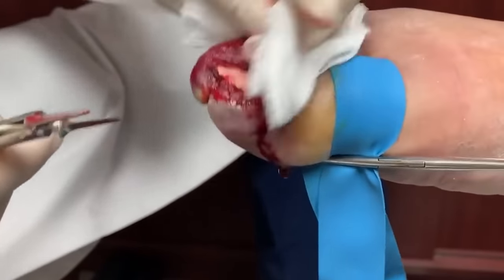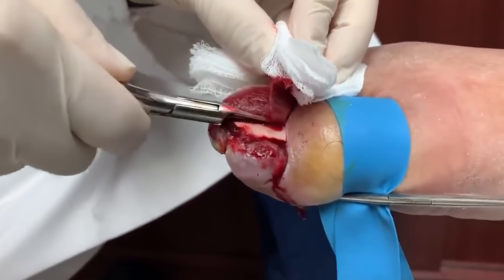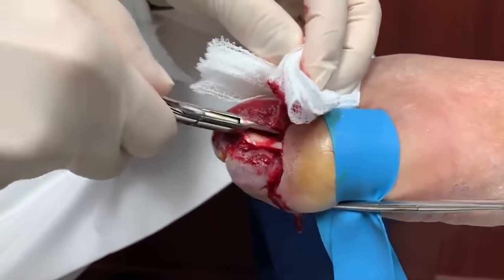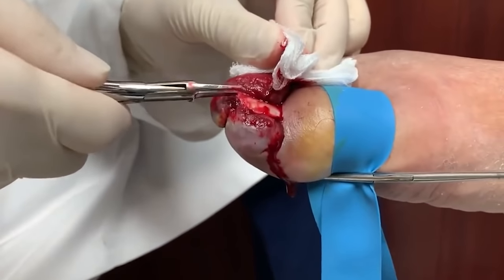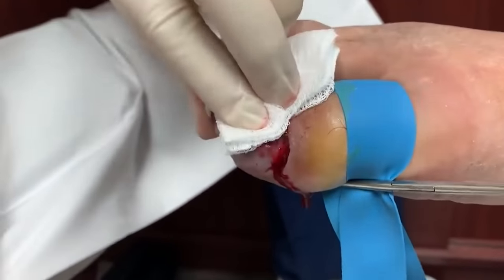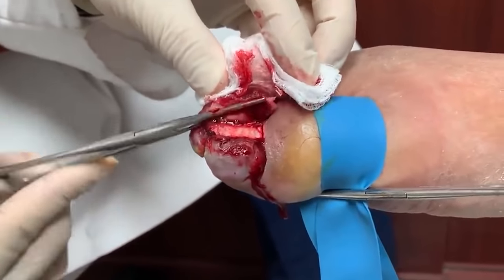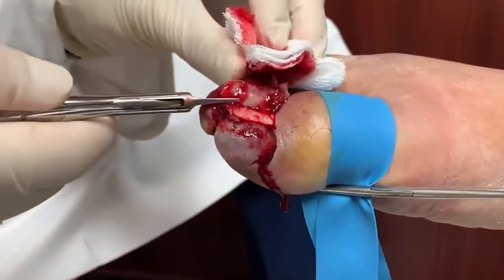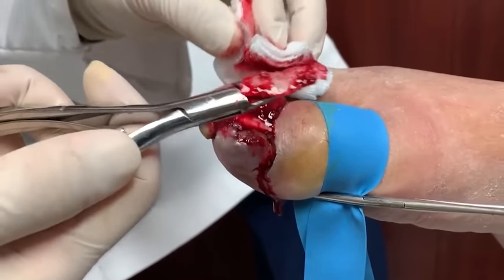It's a little bloody because we couldn't get a really good tourniquet here — it was so large we couldn't get the tourniquet on top. It's a little hiding in there. It's so deep in there. Taking the other part out — and there you go, that's the other part.